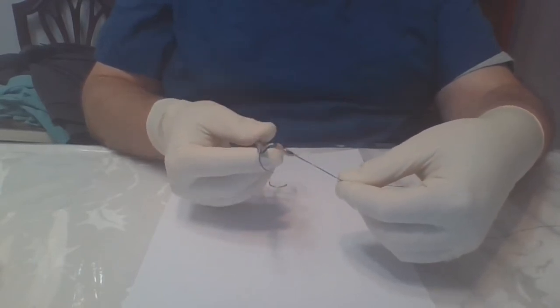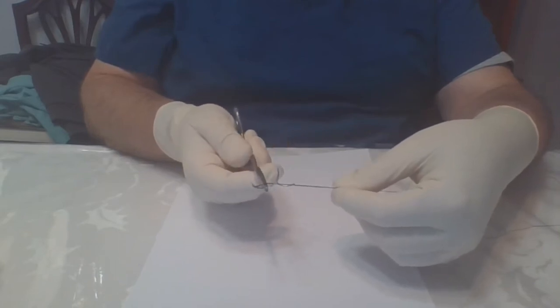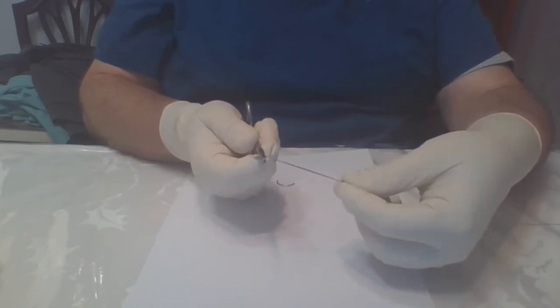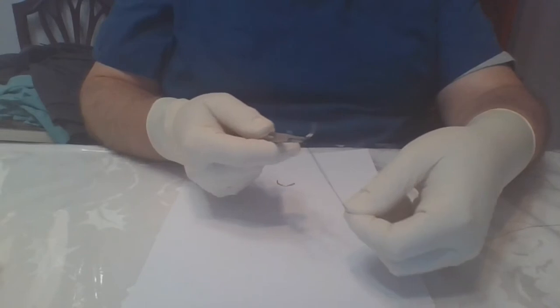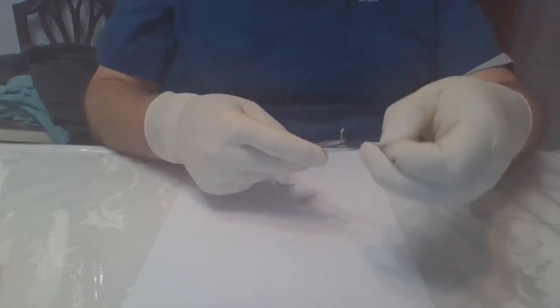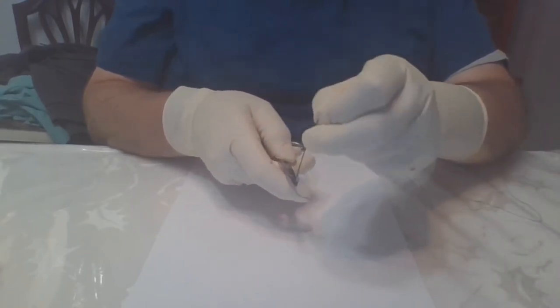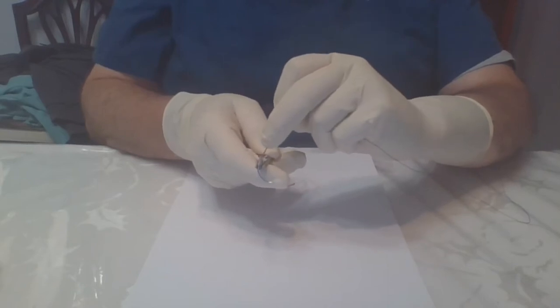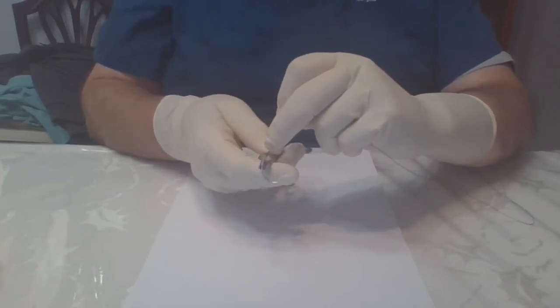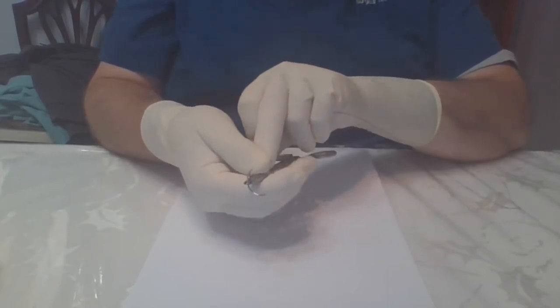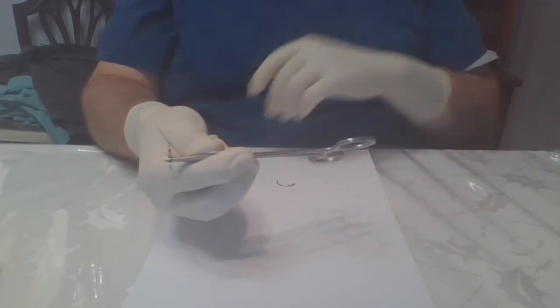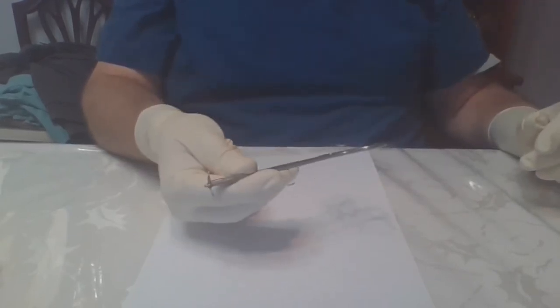Now turn the needle driver so that the suture goes under the needle. Then bringing it in front, up, and over, and then into the jaws of the needle driver right there into the tip. And then just pull that on through and you've got it ready to pass.